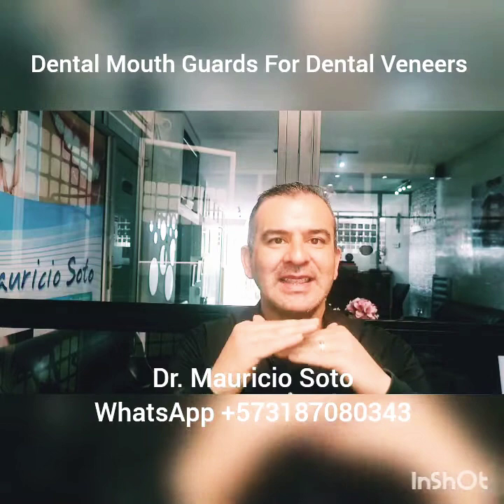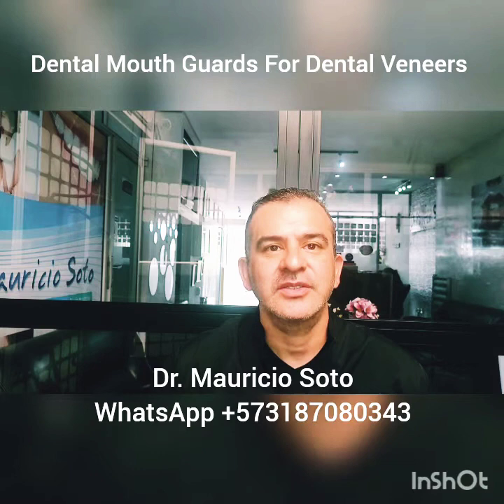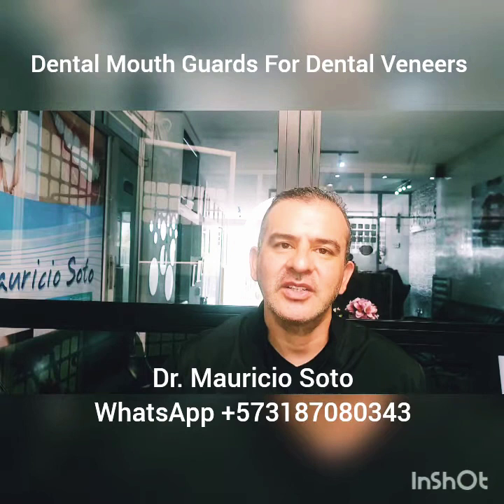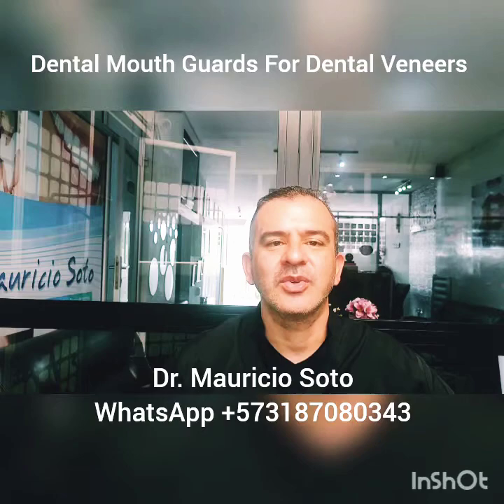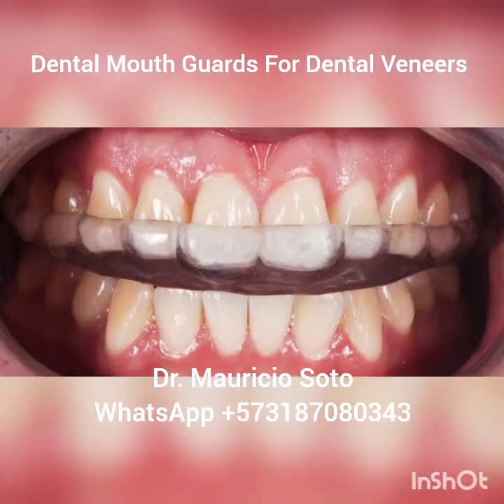The main factor for having bruxism, or grinding of the teeth at night, is emotional stress. And when people grind their teeth at night, it can chip the veneers. For this reason, it is recommended that all people who have veneers — especially composite veneers — use a mouth guard at night for sleeping. Pay attention, I will explain this step-by-step.